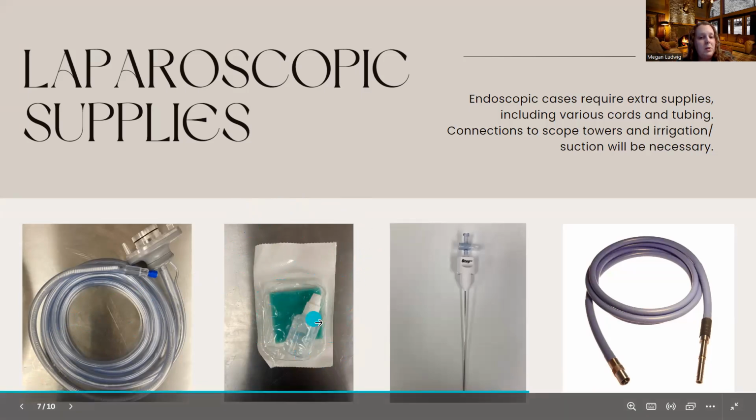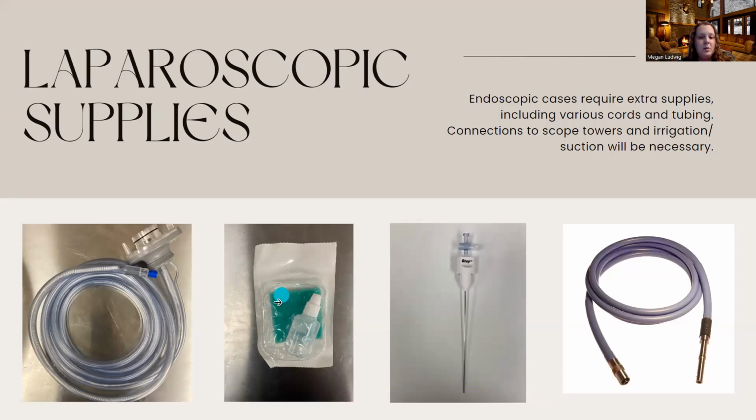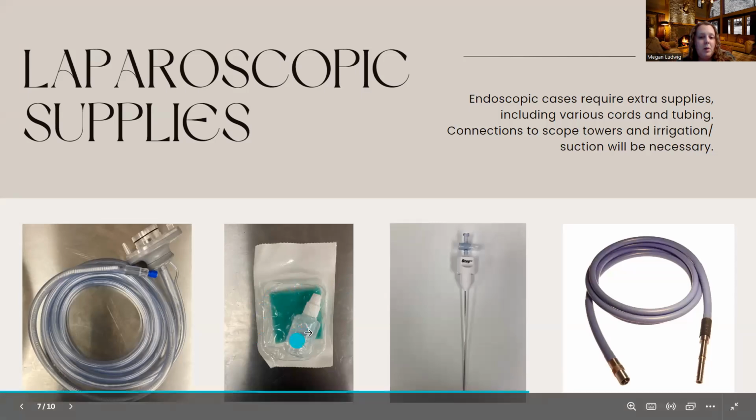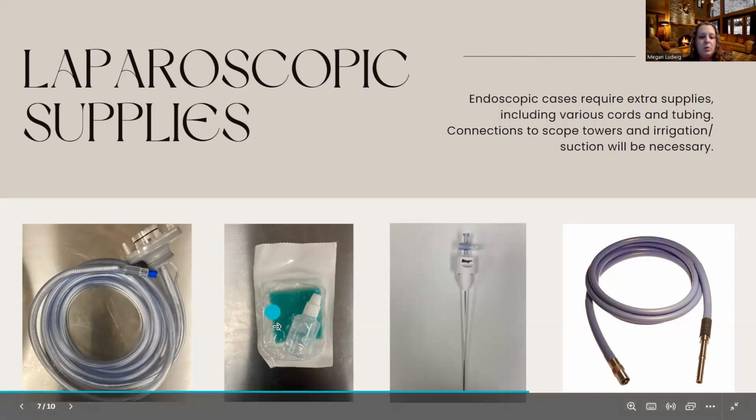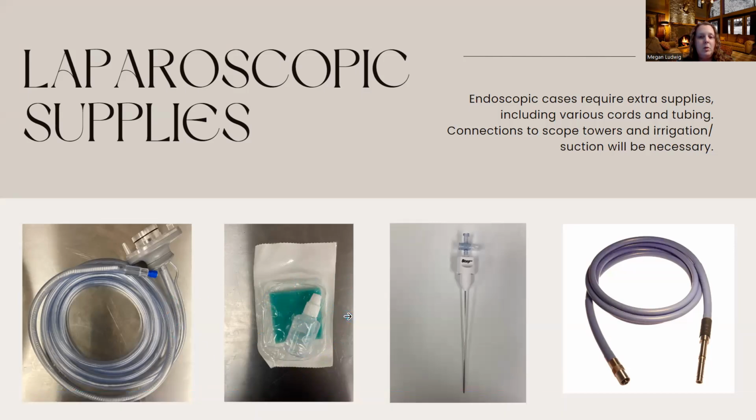Depending on your facility, it could be 2 pieces or 3. I've seen it both ways. The pad, the bottle itself, and the cap can be a third piece. What you do is squirt a little bit of the solution on the green pad, which has a sticky backing, and then rub this little sponge on the end of your scope prior to the case ever starting. That creates a little film over the end of the scope that helps prevent it from fogging up when the scope enters the abdomen.